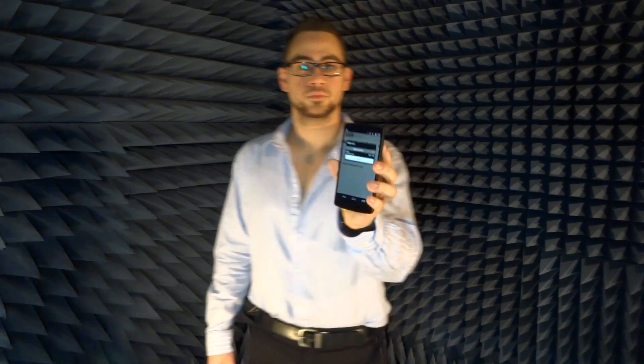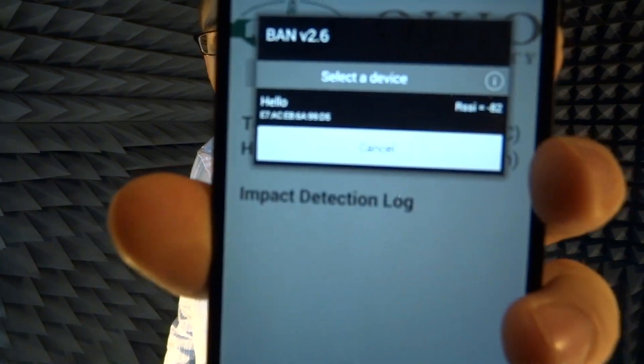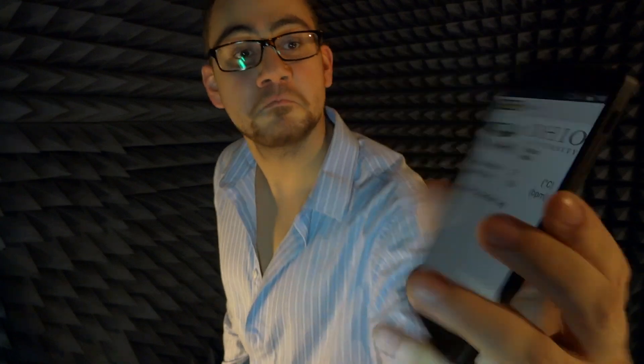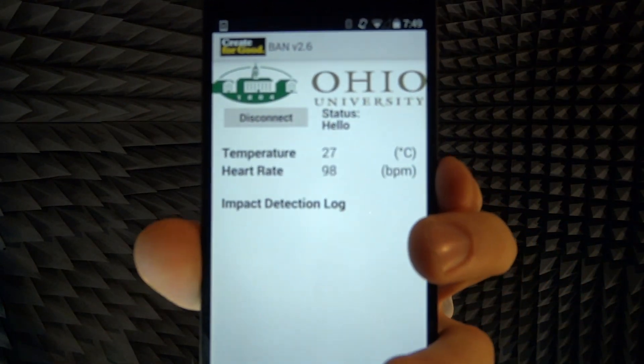The third test is with the phone in the back pocket, locking in the RSSI and reading it back. The RSSI message from here is negative 82 dBm. Now that the device is connected, we're going to read the continuous tests: temperature, measured in Celsius, and heart rate, measured in BPM. The temperature is 27 degrees Celsius and the beats per minute is 106, and that changes quite frequently.